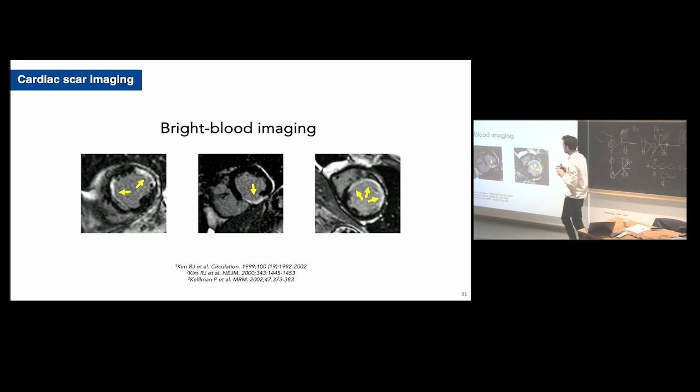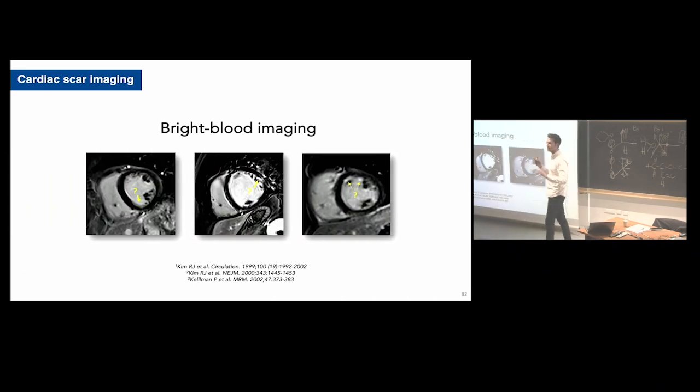Let's go back to the images. Here are 3 other patients we had in Bordeaux with myocardial infarction. That technology works pretty well, right? You can see it. We have the bright pixels here. Yes, this patient has myocardial infarction. This patient might have 2 coronary arteries occluded. We see it pretty well. The problem is that in between 15 and 20% of the population, we have contrast issues.